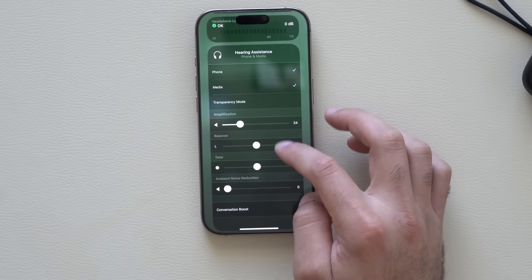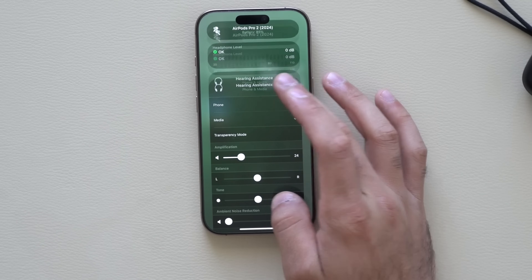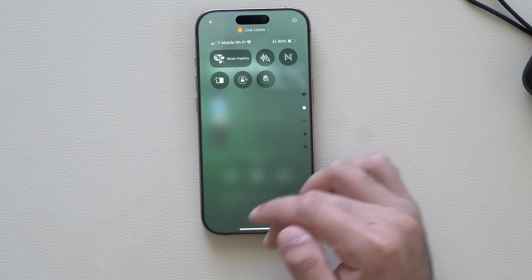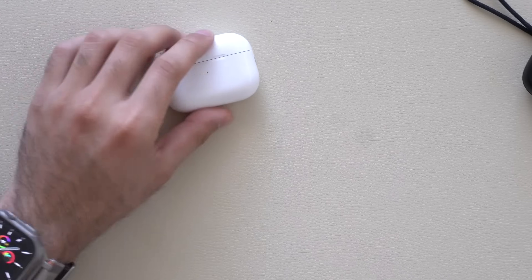Back in the Hearing section, you'll also see Hearing Assistant controls where you can adjust the balance, tone, and more — essentially an EQ for the hearing assistant. Above that, if you're playing media, you can monitor the decibel levels of the audio you're listening to.